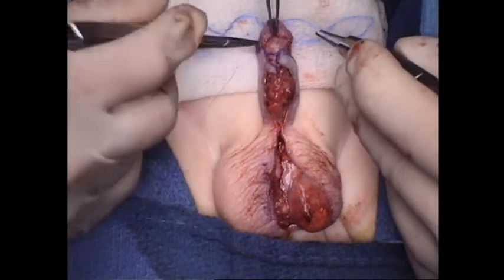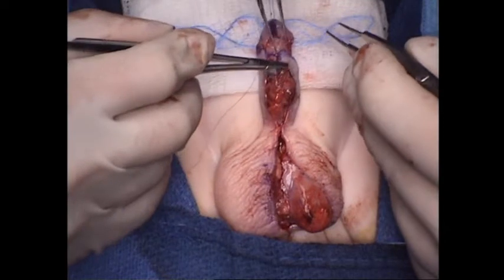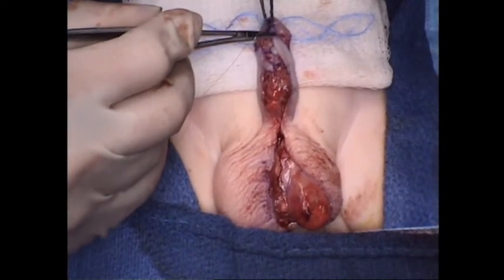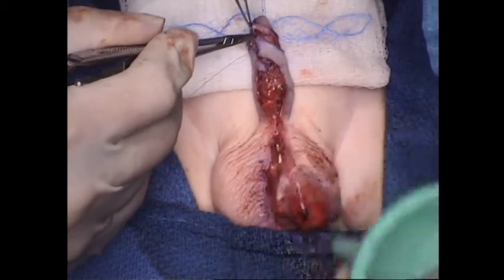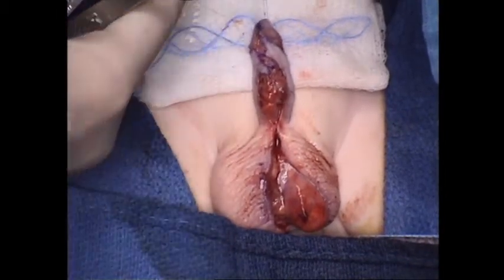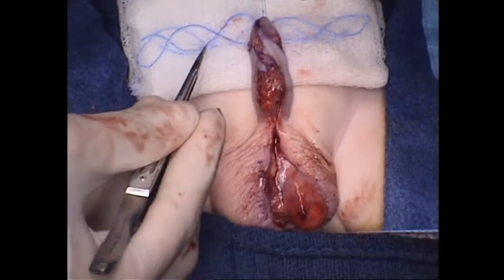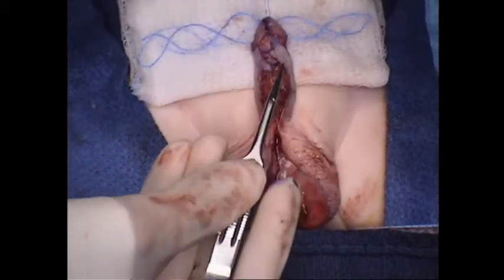So all these little details, and this is all going to go away. That's our midline incision. The edge of our corona is right here, so we'll take this little triangle of skin off. All of these little details make a big difference when these kids grow up and get bigger, and you can see where shortcuts were taken. So you see that we spend quite a bit of time on these details to make things perfect, as much time on the skin as we sometimes do on the entire hypospadias repair.